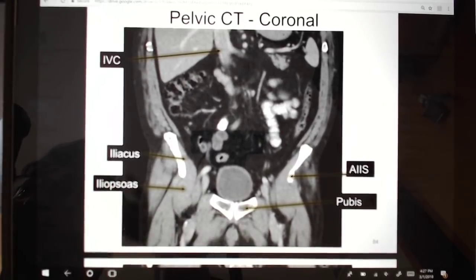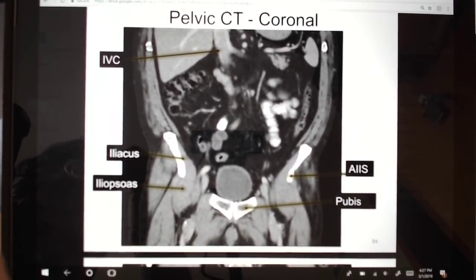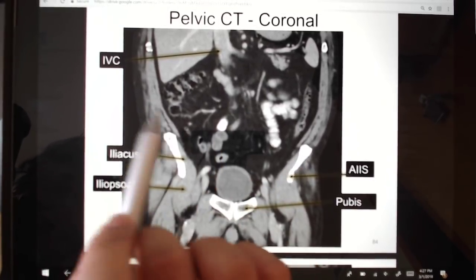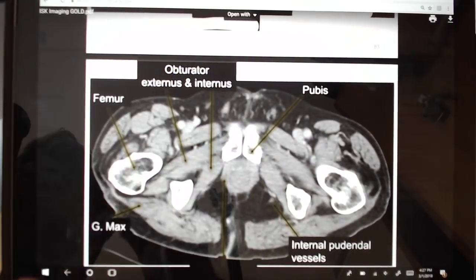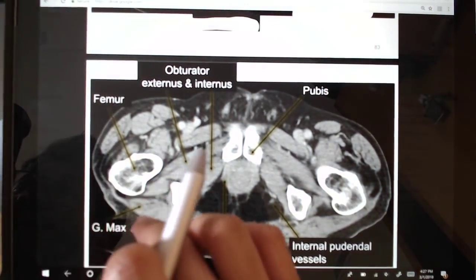They can only go so far as far as cut sections are concerned. You can only make maybe 3 or 4 cuts, as opposed to the transverse ones where you could go up and down the body all the way from the feet to the head, right?